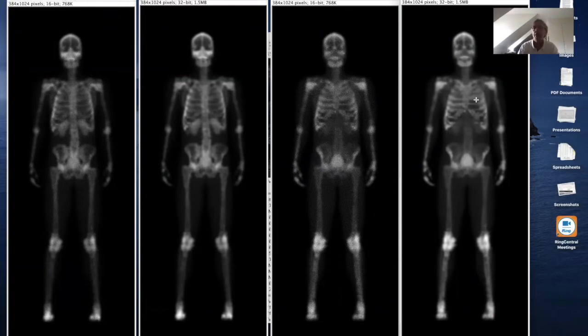That is regarded as the average, and then noise is added to it accordingly. You can add noise in the actual simulation, but this is preferable, because you can reuse this image here, this one here, and this one here, and make noise realizations using the same average.